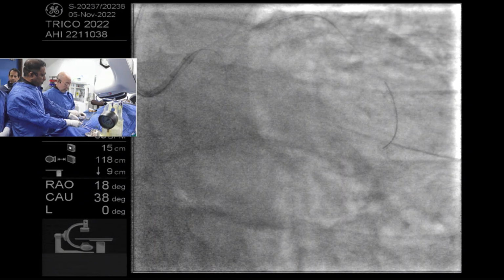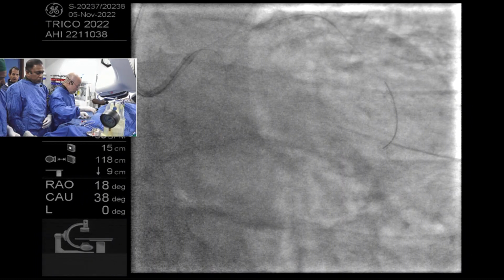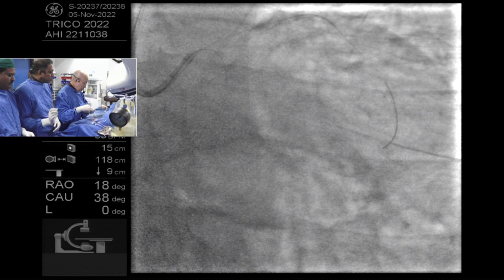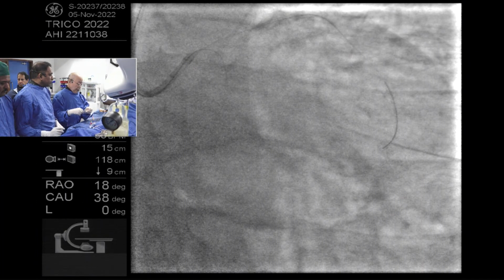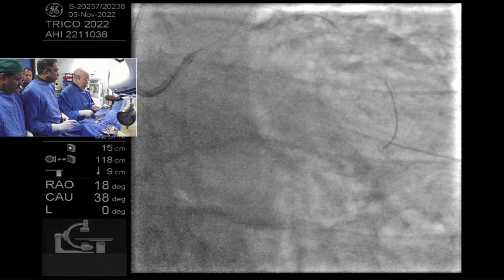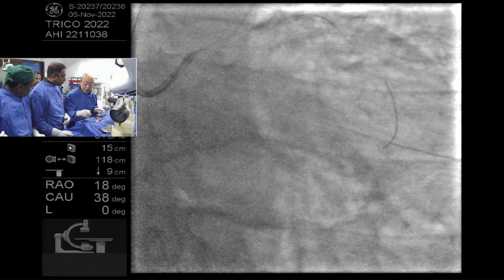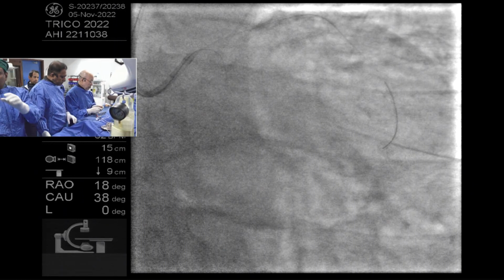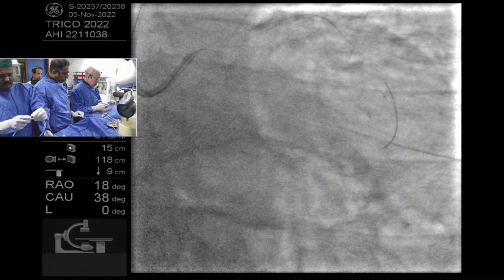So, microcatheter, please. How about a Pilot 50 wire? You think maybe something different? Maybe. So you can put this wire in the distal LCA, straighten the curve, and then possibly go with another wire for the OM1.